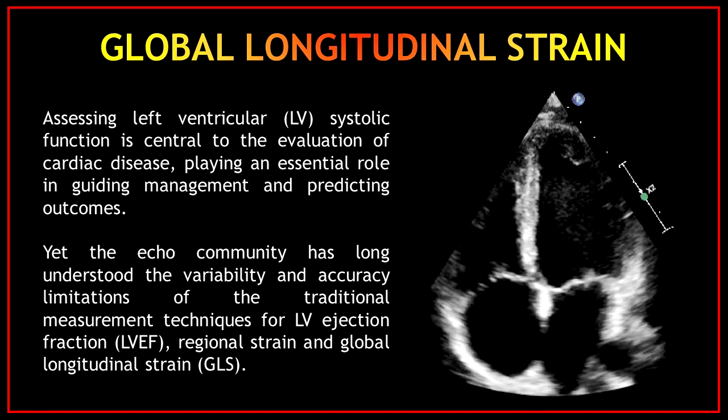Let's start with the basics of global longitudinal strain. Assessing left ventricular systolic function is central to the evaluation of cardiac disease, playing an essential role in guiding management and predicting outcomes. Yet, the echo community has long understood the variability and accuracy limitations of the traditional measurement techniques for left ventricular ejection fraction, regional strain, and global longitudinal strain.